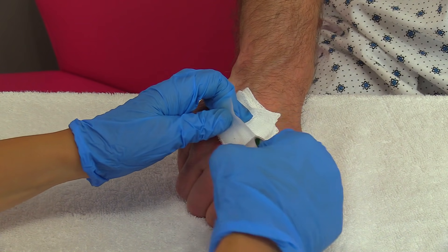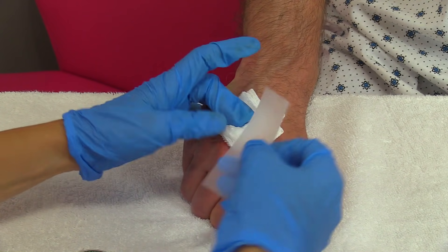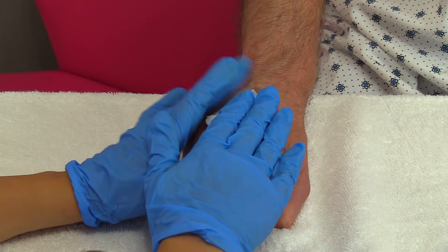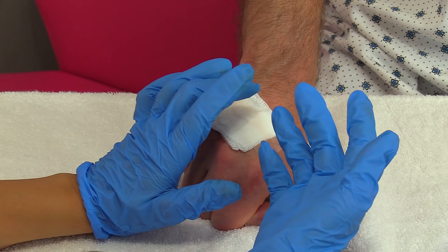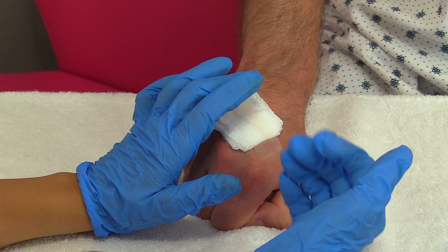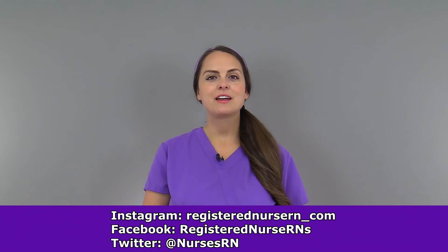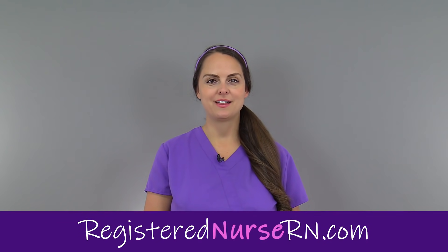Take some tape and tape over the gauze to secure it. Then remove your gloves, perform hand hygiene, and document that you removed the patient's IV. That wraps up this video — if you'd like to watch more videos on nursing skills, you can access the link in the YouTube description below.